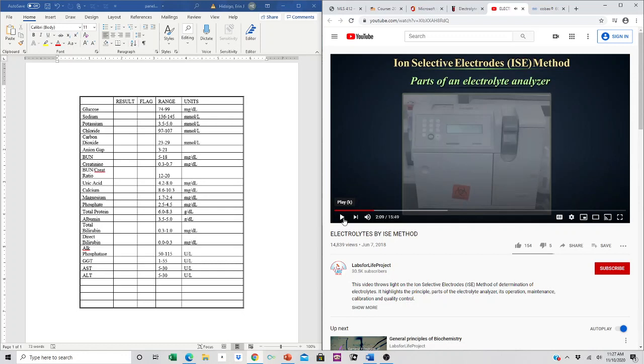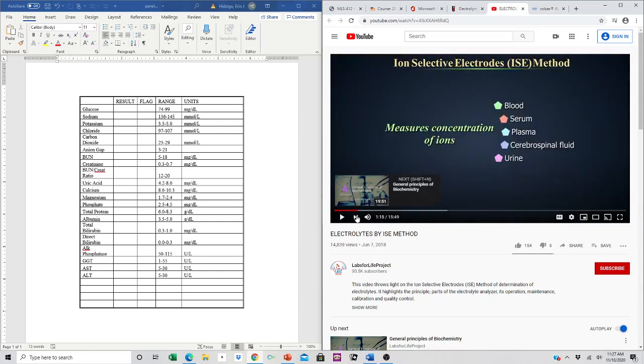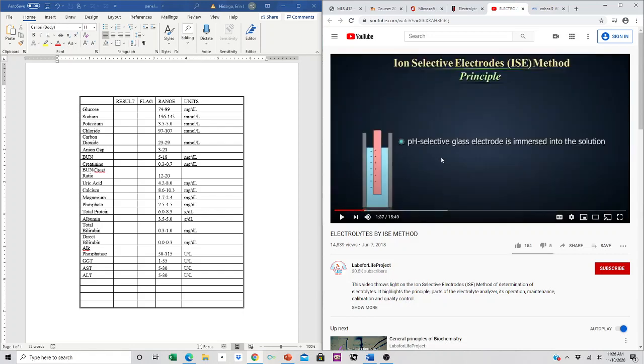Okay, so you are not responsible for anything she just said on the video for your exam in here, but it was a good review of information since that instrumentation module is in the other class. On your BOC, it is good to remember this concept. It'll have the buffer solution, the glass electrode, the ion selective electrode.